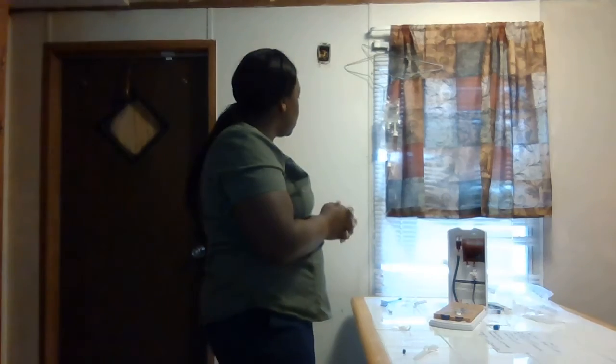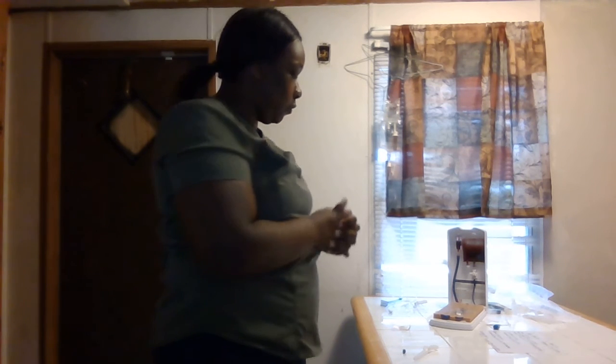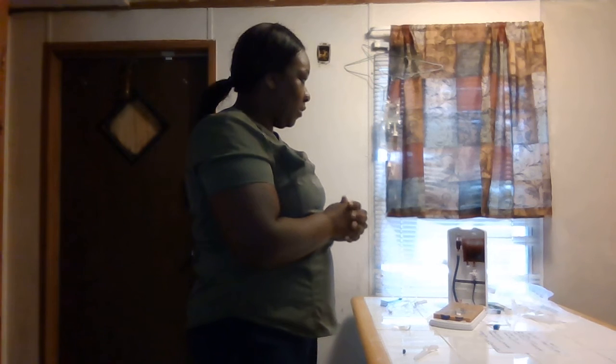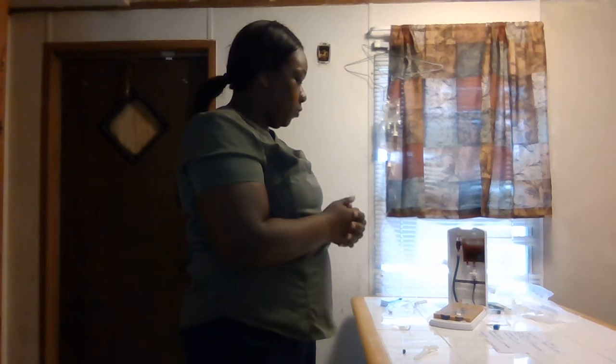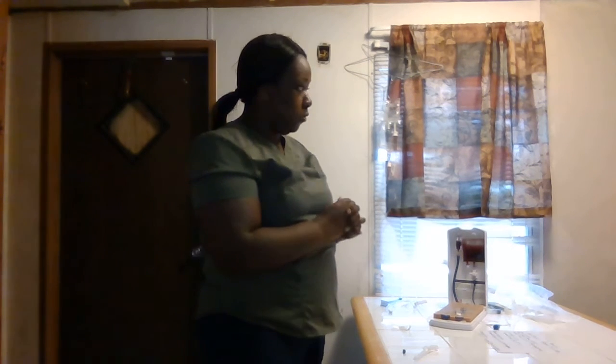Okay, so now my patient needs to go to X-ray, so we have to convert to an INT. So again, you gather your supplies. You'll have your gloves and your goggles on.